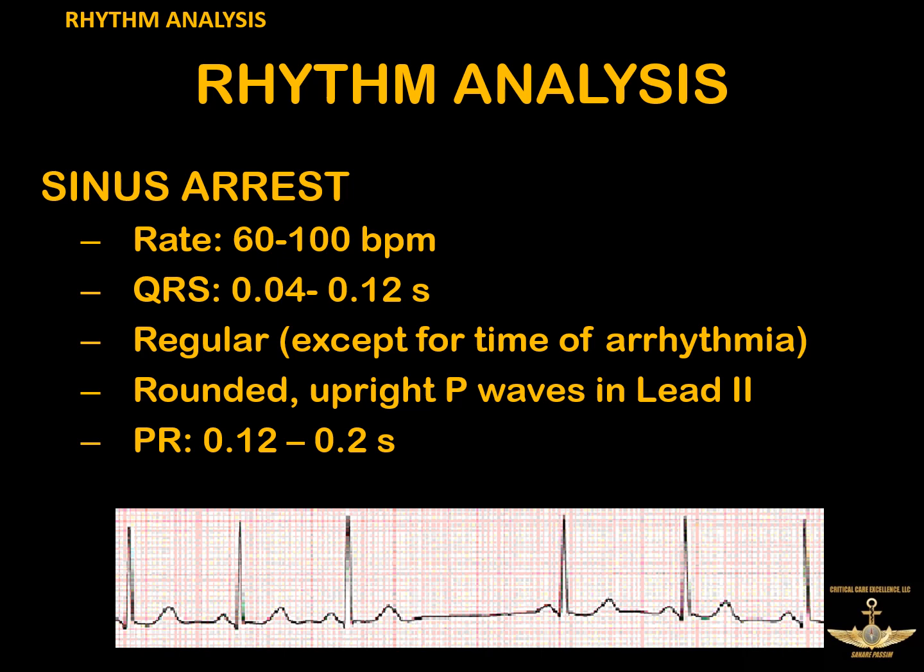Usually it doesn't mean anything unless somebody has it in conjunction with some variable degree of heart block, which we'll talk about later. But otherwise, again, you may see this on a test, you may not, but it's just something to know about.